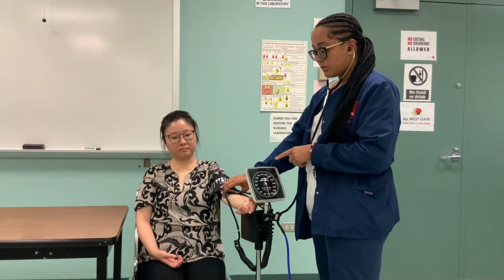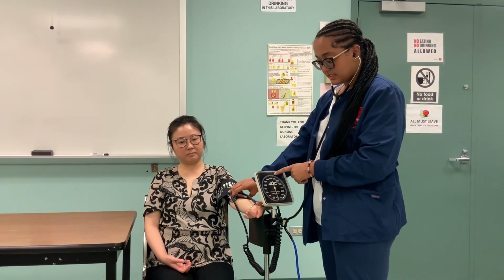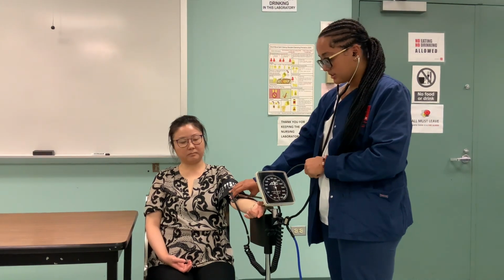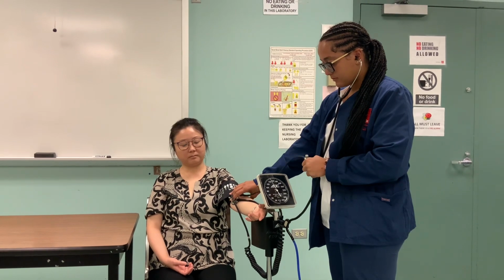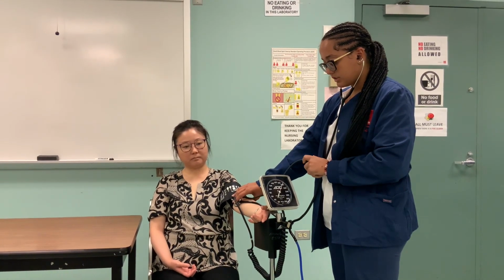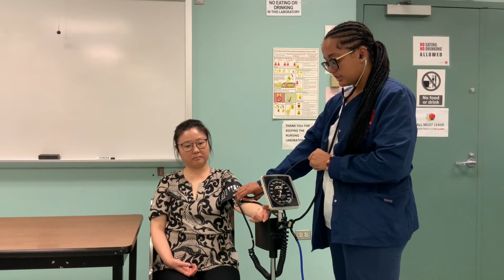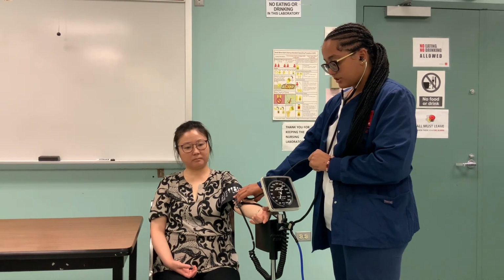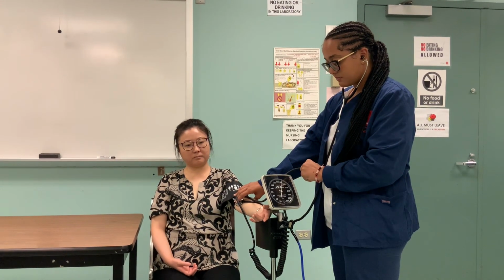And now that we know what our estimated systolic is, we're gonna pump 30 more. So since it was around 160, we're gonna pump it to 190. So I'm just gonna start pumping. And now that I'm at 190, you're gonna slowly release the knob. So you wanna tilt it really slowly and smoothly where you could watch. And you're gonna be listening for a faint sound.